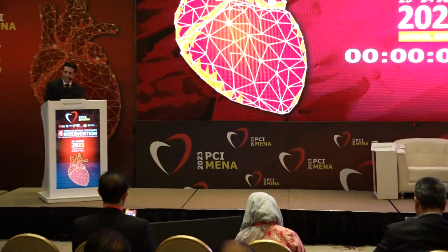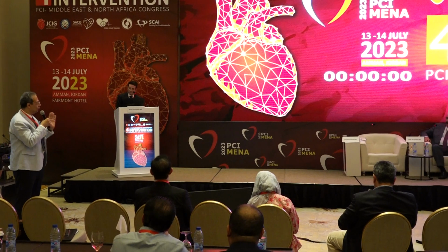My question to Dr. Abdallah about the retrograde. What's the criteria of the lesion when you start retrograde from the start? Sorry, Dr. Amr, about the criteria of the CTO lesion to decide that you begin with retrograde, not antegrade. Yes, this is a very important question. The first thing is if you have an ostial lesion, a flush ostial lesion with the aorta. This is a very important point that you need to start retrograde, so you cannot go antegrade.